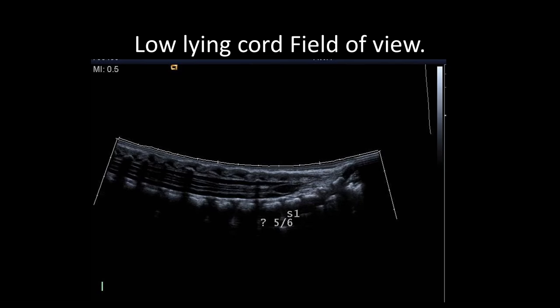Right. Next question, have you ever seen an indication for small anterior fontanelle for a 2-day-old baby? Sorry, so I think you're asking, would you actually do an ultrasound because there's a small anterior fontanelle? Well, certainly if the small anterior fontanelle is associated with the concern, are these sutures overlying or are these sutures fused, yes, you would be reasonable to do an ultrasound for that, and that would be one of the times that I would actually look at the sutures. Because you can actually tell are the sutures open or closed. You might not be able to define how far open they are in terms of millimetres, but you can tell whether they're open or closed.